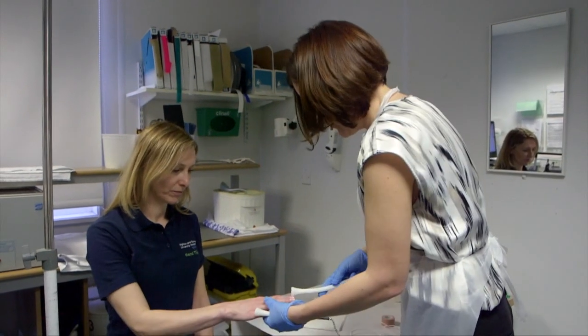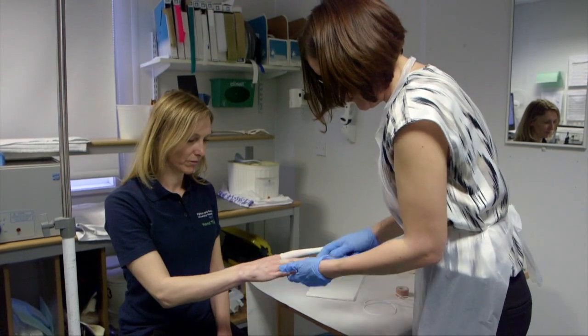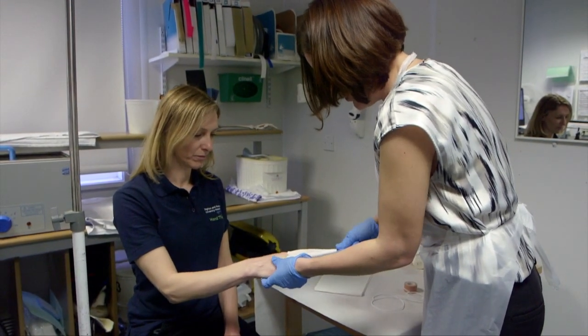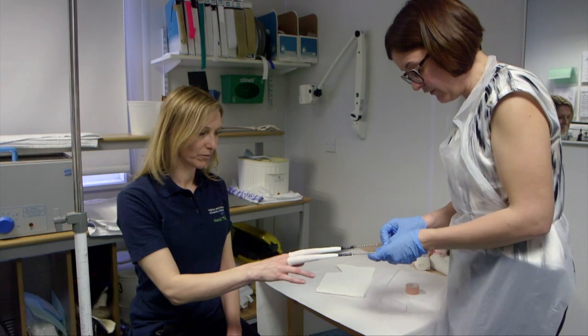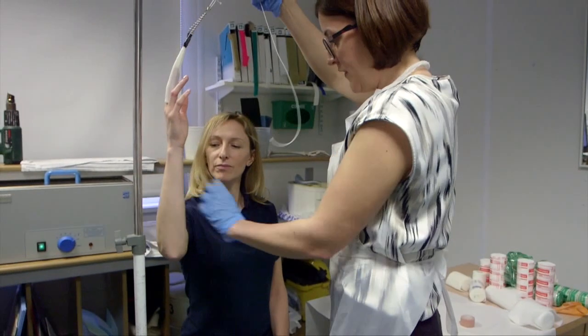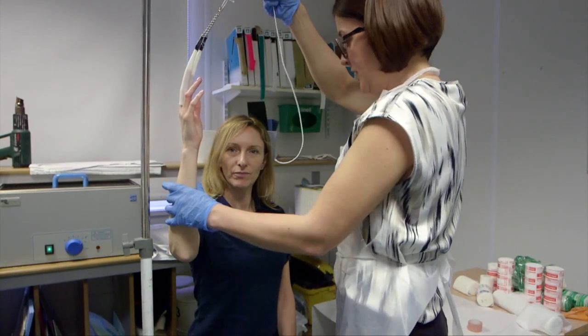To apply the traps, you just gently push the traps up the finger and then they lock. Fracture reduction takes at least 20 minutes, but the patient can safely be left there for an hour or two. This helps with pain relief and also makes it much easier to apply a plaster. Ideally, when you're attaching the patient, you want the shoulder to be 90 degrees and the elbow 90 degrees.